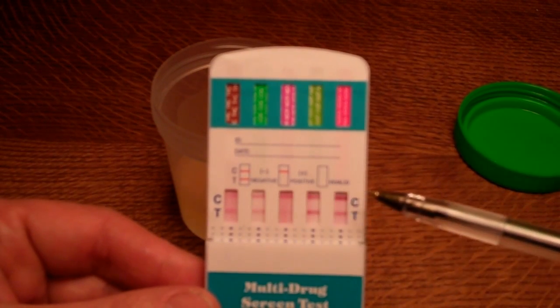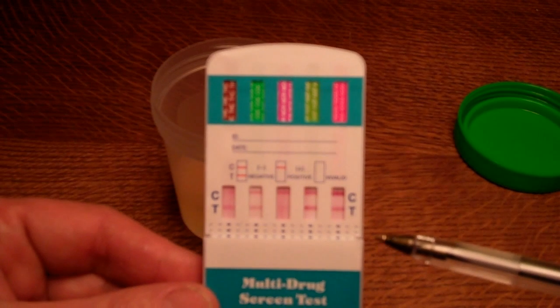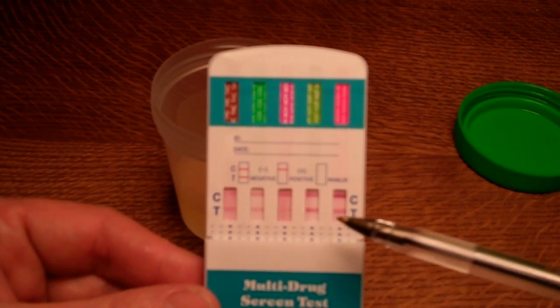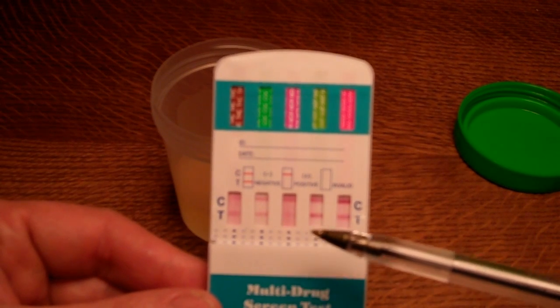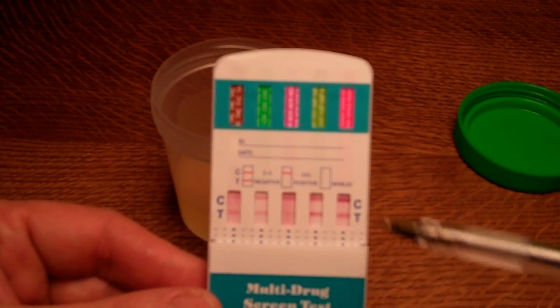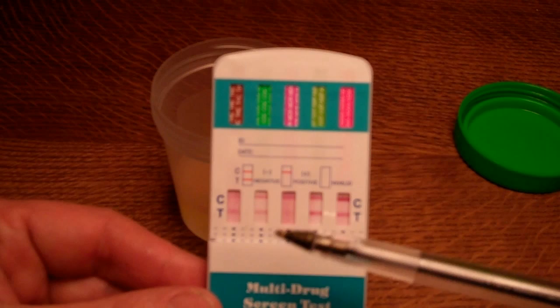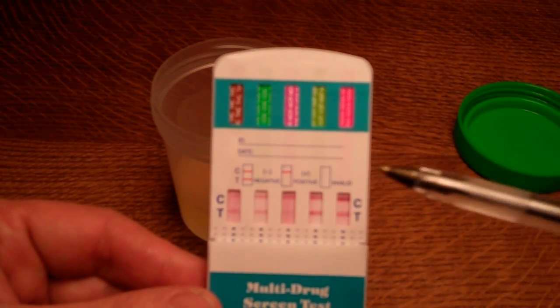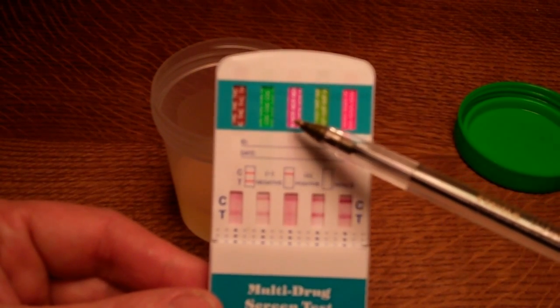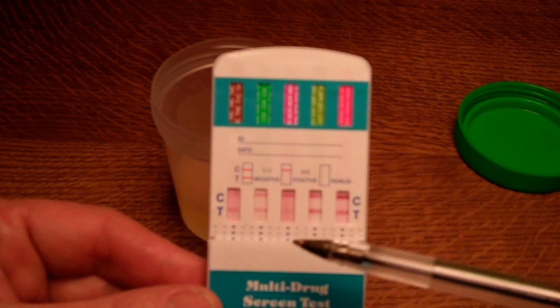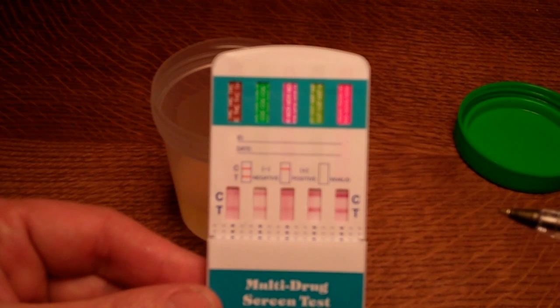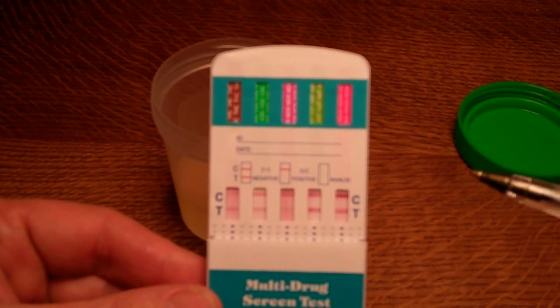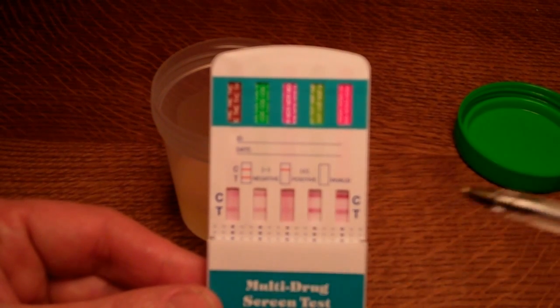On this particular panel, we can see that we've got control lines forming on all five drugs and we've also got test lines forming on all five drugs. Now you will notice that there's quite a bit of variance between the different test lines in terms of their thickness, the color density and saturation. Particularly on this test membrane on the MOR opiate test, the test line is still quite vague.